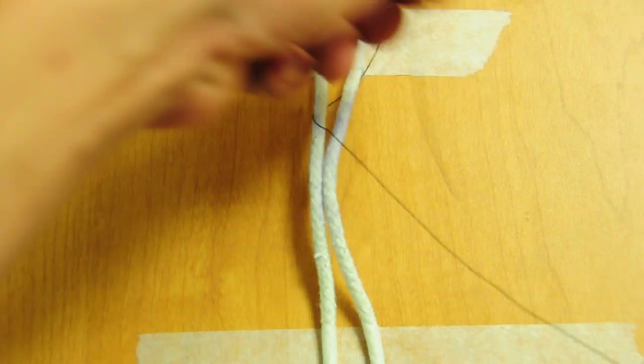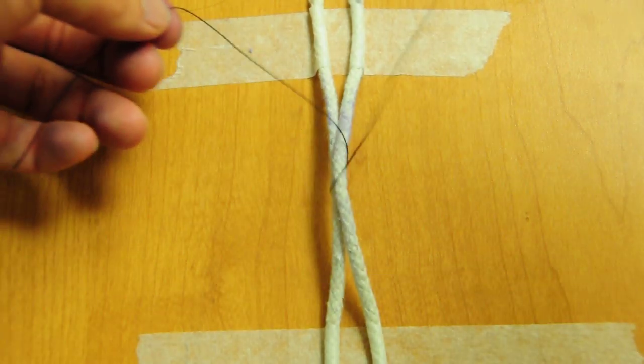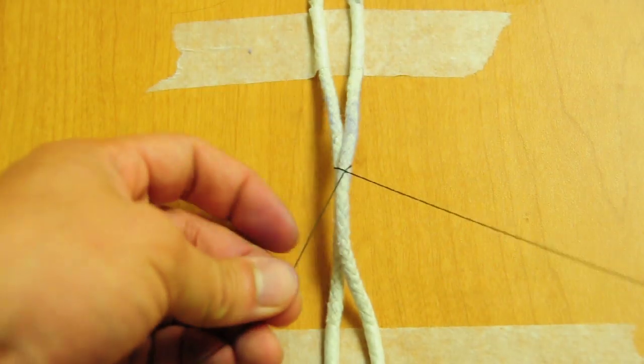So remember, you're pulling through. You don't want to leave a lot of tail. Otherwise, it's harder to tie your one-handed knots. Just take as much as you can. Conserve suture.